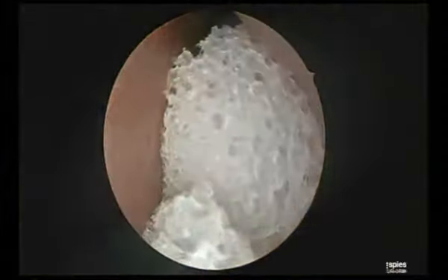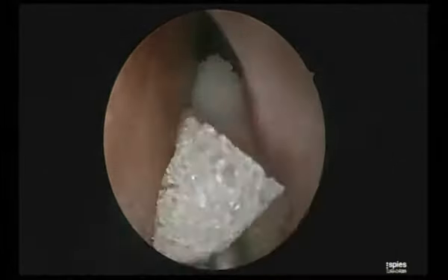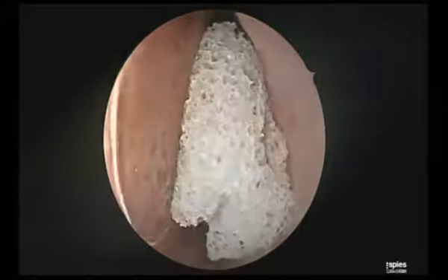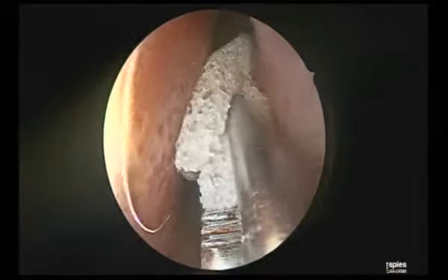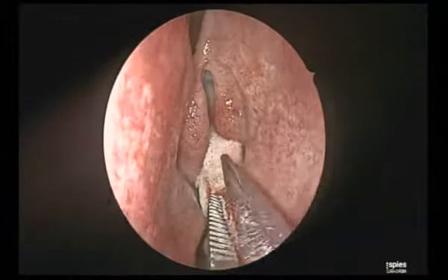Any chance the camera magnification is slightly higher? Can you go to the lowest ring? I don't know, the picture is looking good on the monitor, but I was thinking. I don't know how to do that. Audiovisual guys are good, the picture is befitting on the screen. We are good too. Thank you.